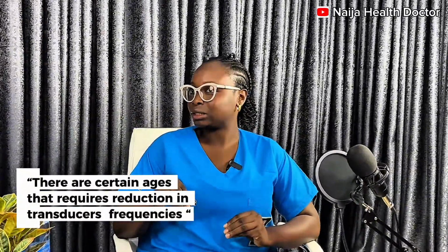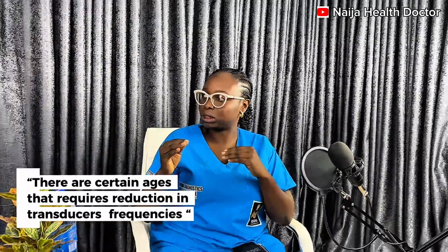Using ultrasound on patients, is there a certain age that cannot use an ultrasound machine? From the pregnancy itself, they use ultrasound to check pregnant women and the fetus, so there is no age that can't use ultrasound. But there are ages where you have to reduce the frequency of the transducer you're going to use.